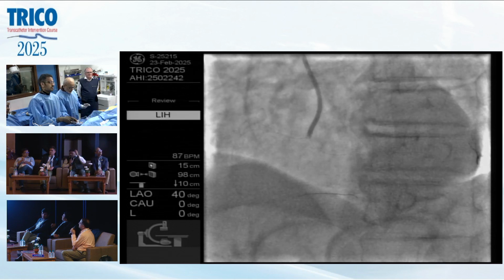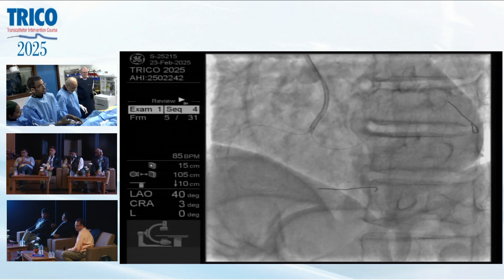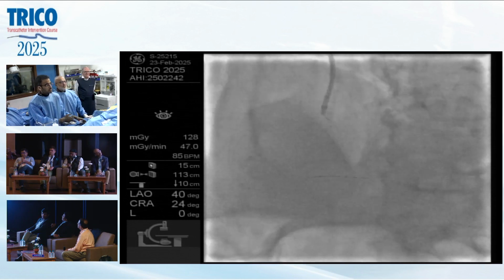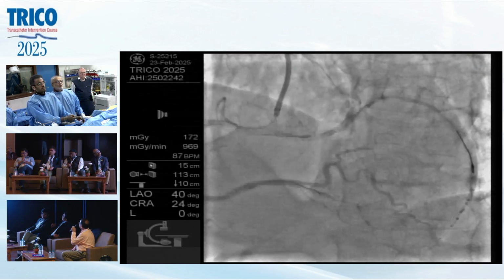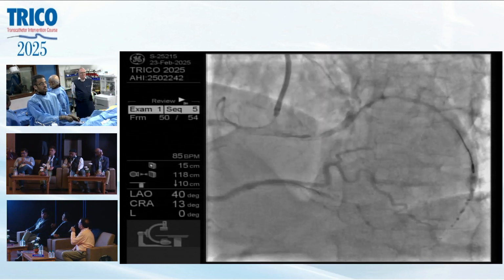Can we take that RCA wire now? I will show you in a cranial view. Go to LAO cranial. Show me the distal tip. It is perfectly well placed, I suppose. Yeah, that looks very good. The wire position is good. I think the flexible stent is the solution.